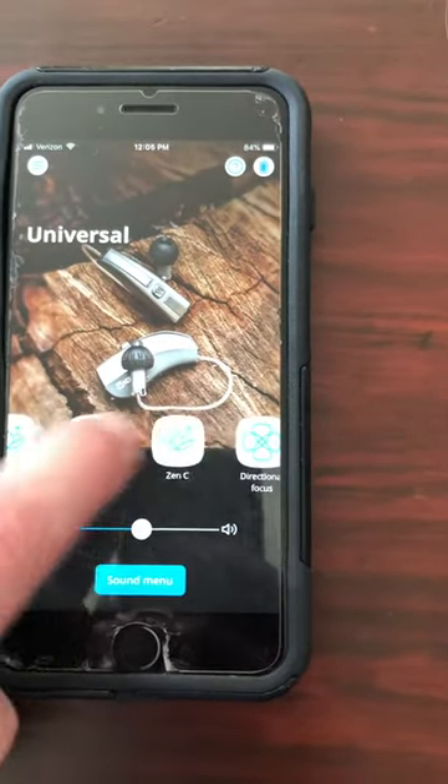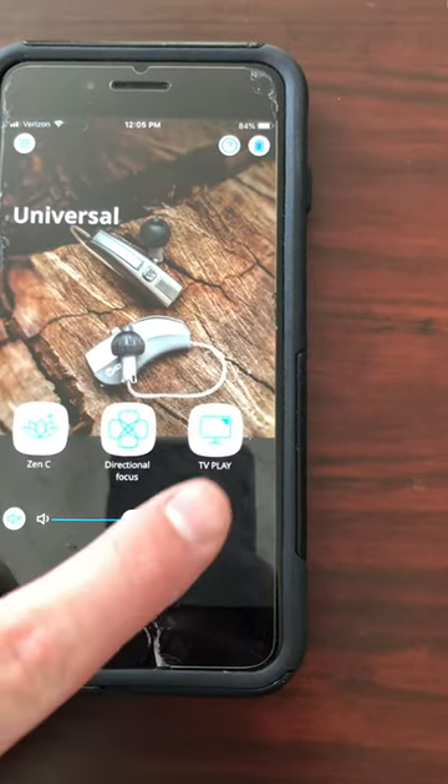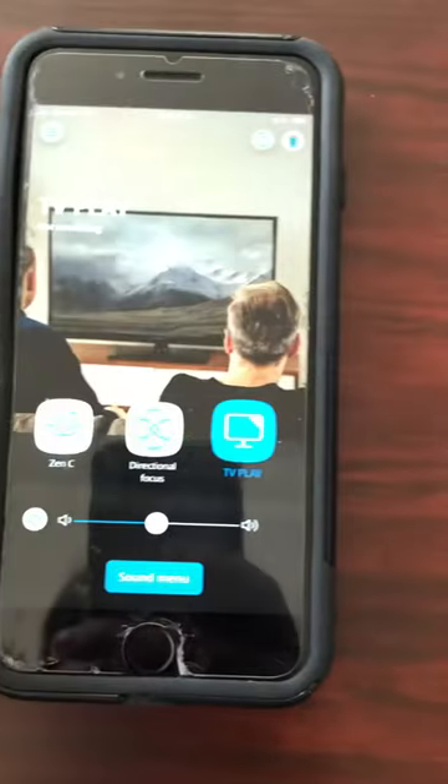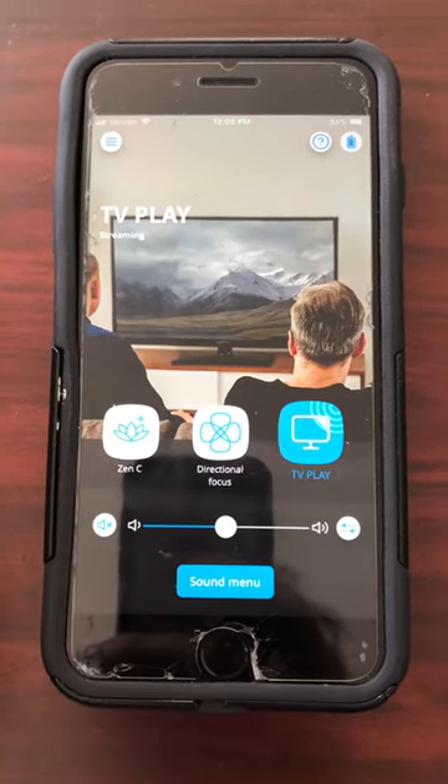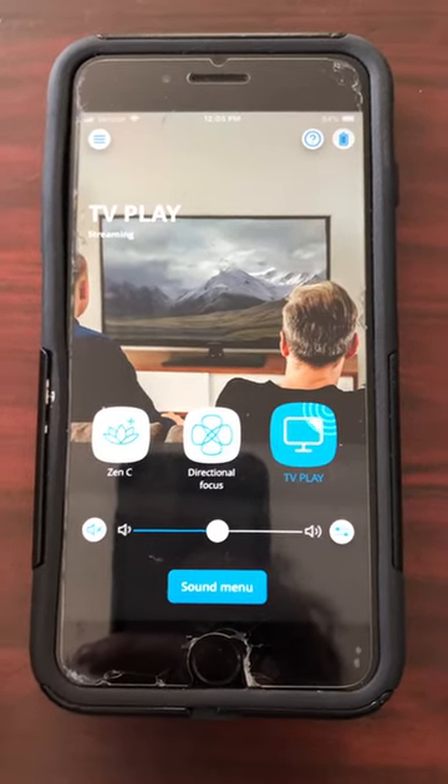You want to scroll over to TV Play right there and tap it. Once you're in TV Play, it's going to be transmitting the television's audio directly to your hearing aids.